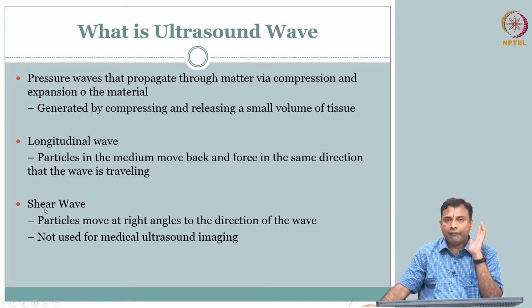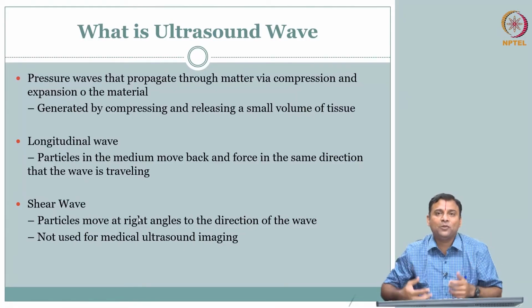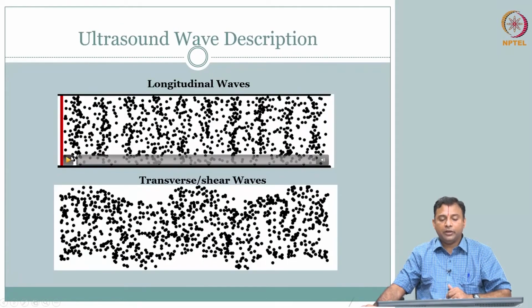We will ignore shear wave because our body, what is our body? Oh, we are mostly water. So, we are a liquid body, 70% water. So, we are all fluid. Essentially it will not support shear wave, or for all practical purposes your soft tissues are water heavy and therefore will not support shear wave. So, this kind of motion is not supported in biomedical soft tissues, and therefore we will focus only on longitudinal wave. So, let us just take a couple of animations.